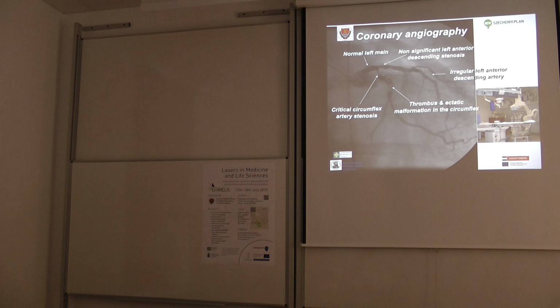So I told you about angiography. This is the process where, through the catheter, a contrast dye is injected selectively into the proximal part of the coronary artery.